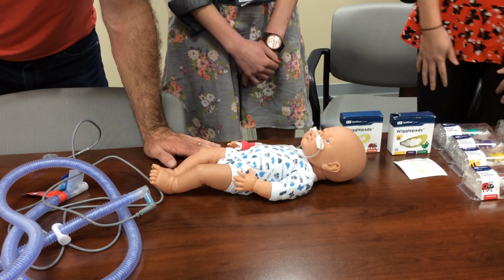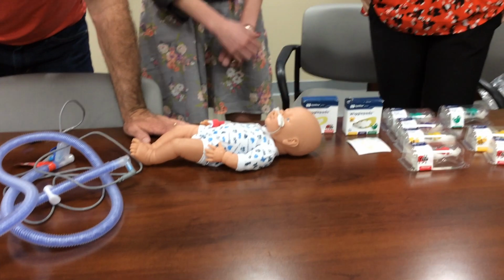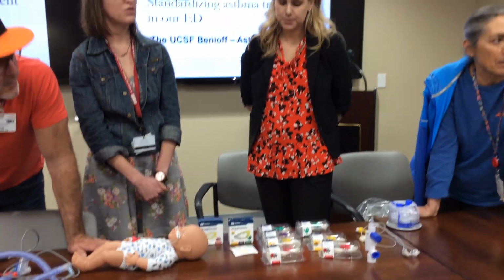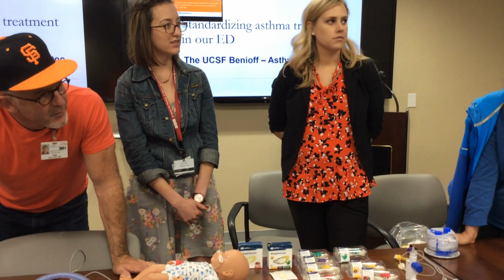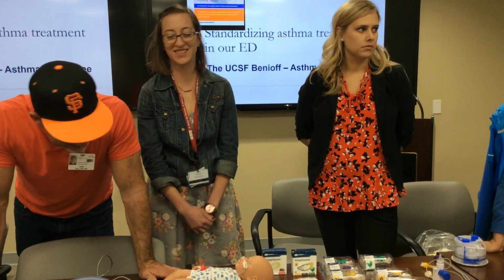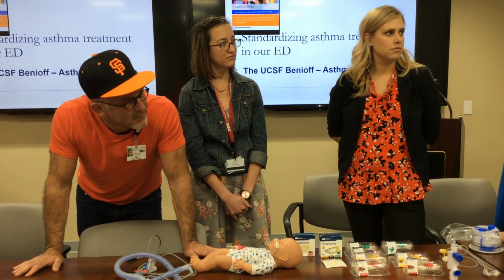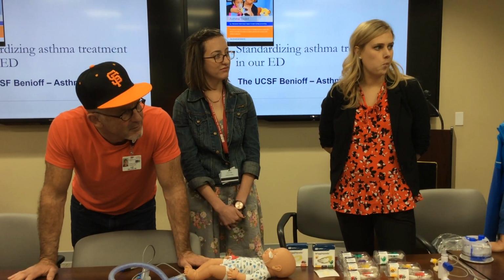And they'll be humidified, so you'd have less need to put the saline in to get the secretions out. You guys still use saline? No, when we suction, yes, saline. Because sometimes their secretions are pretty dry. Are we not supposed to do that? We think it works well. Well, if you put normal saline on a snotty thing, it does nothing. It doesn't break up mucus or anything like that.